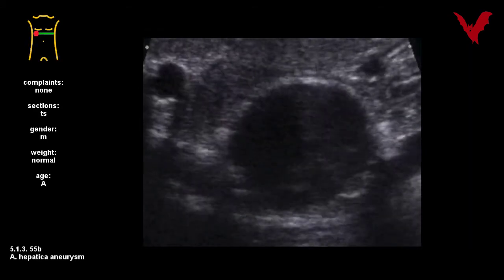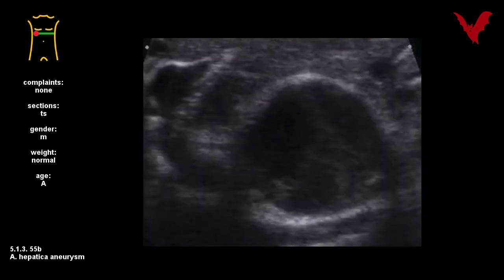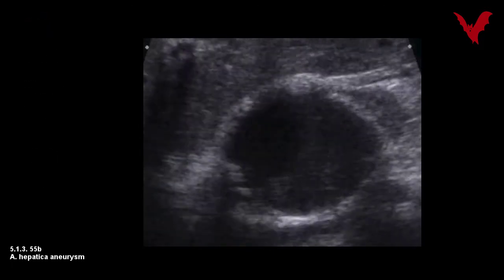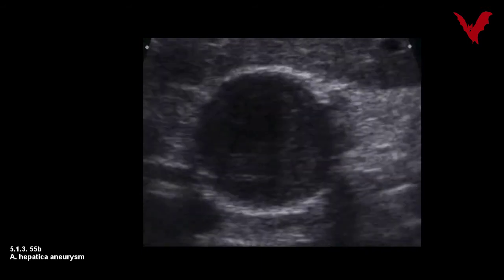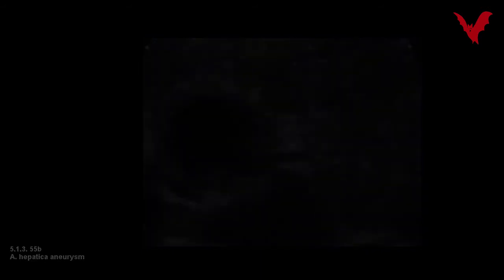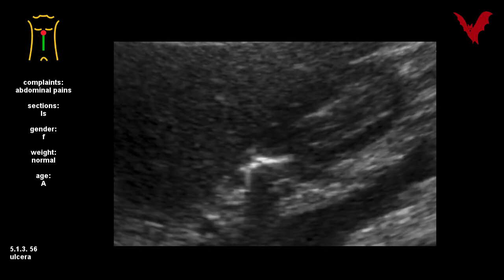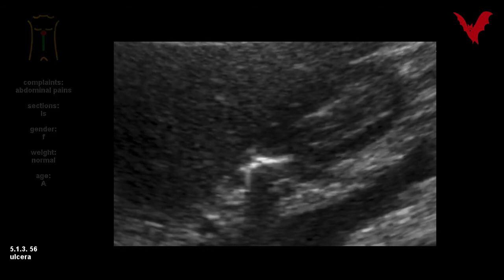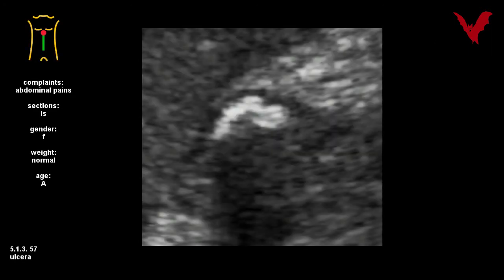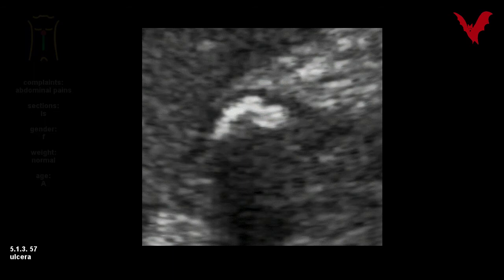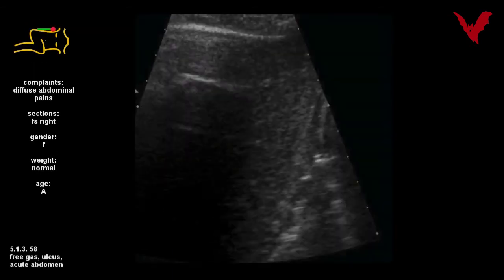Also asymptomatic is this incidental finding in 55b: an aneurysm of the hepatic artery. Both cases 56 and 57 show constantly captured gas in these huge ulcer craters — the first behind and the second before the pylorus.